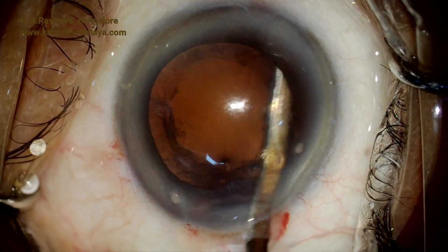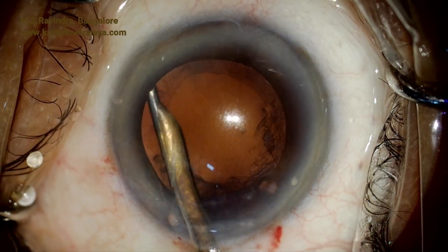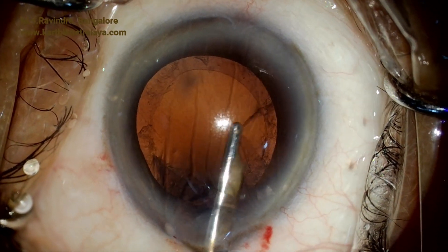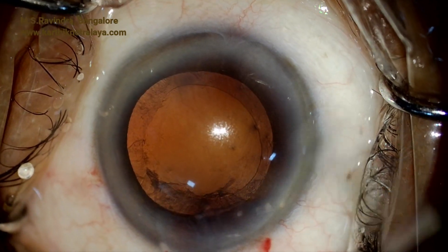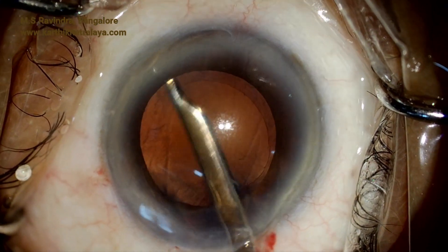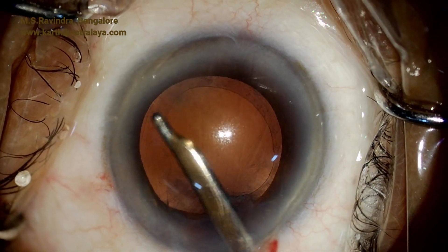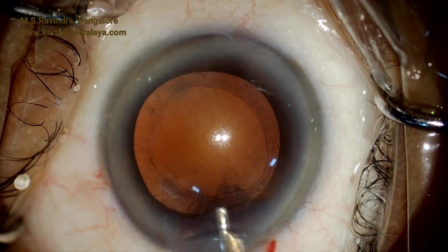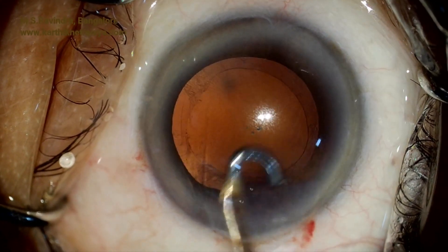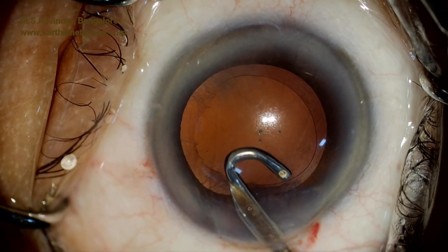The Simco cannula, mounted on a silicon bulb, is used for aspiration and irrigation, both controlled by the surgeon based on visualization of the anterior chamber through the microscope. There is no shallowing or deepening of the AC, which would stretch the posterior capsule backwards and put stress on the zonules. This is done at normal AC depth with very low intraocular pressure. The fluid is controlled, and only about 25 to 30 milliliters of balanced salt solution are needed for the completion of surgery.